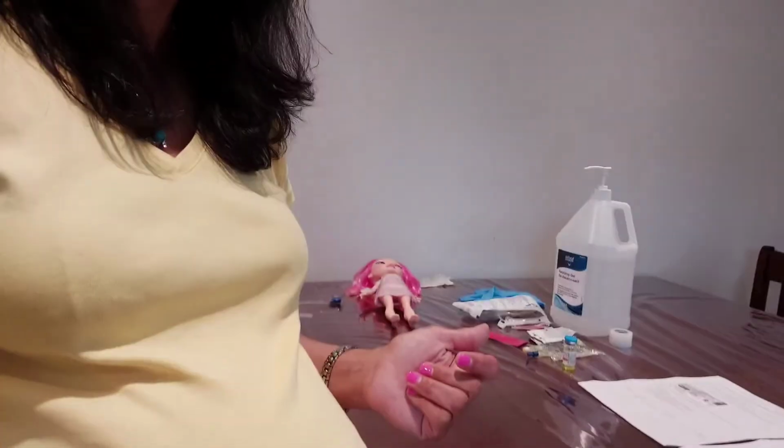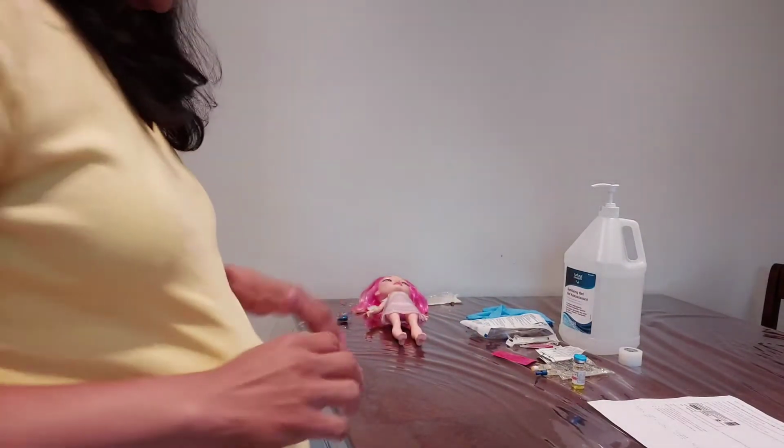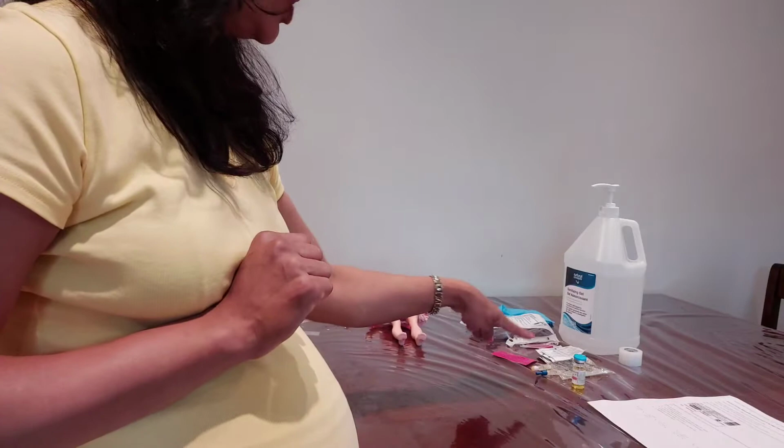So now I know everything, and I should make sure that the medication is compatible with the primary infusion solution. Everything is okay, and I will do the rest. Now I'm going to draw the medication and inject it into the mini bag. First, I will do hand hygiene.